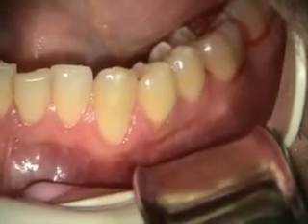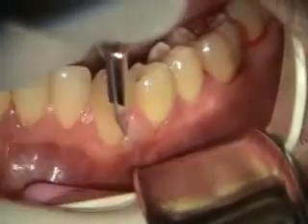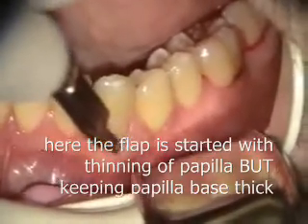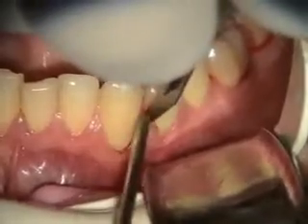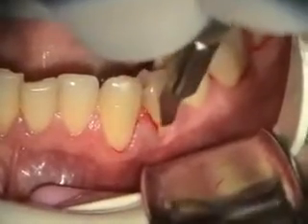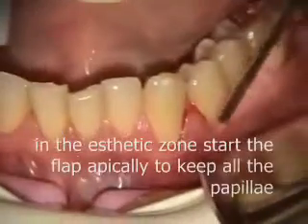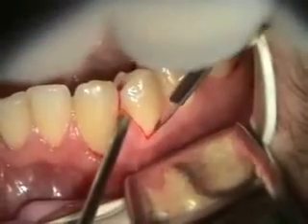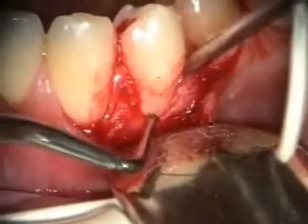He also had some pocketing on the distal of number 18, secondary to a third molar removal, so we've already scoped that. Hard to tell, but it could be just the very beginnings of root resorption — what I felt is this little ditched out area here.